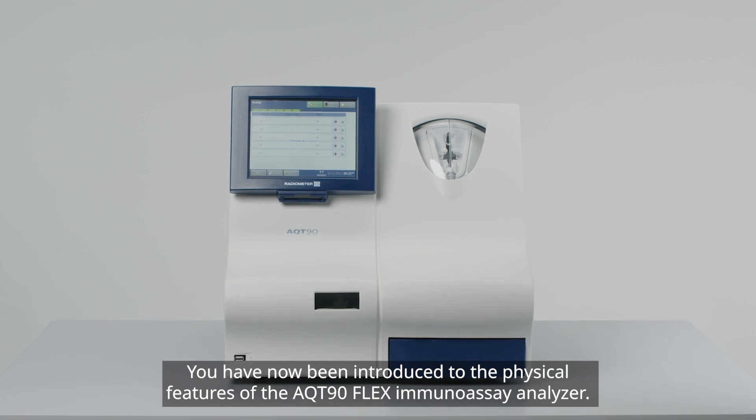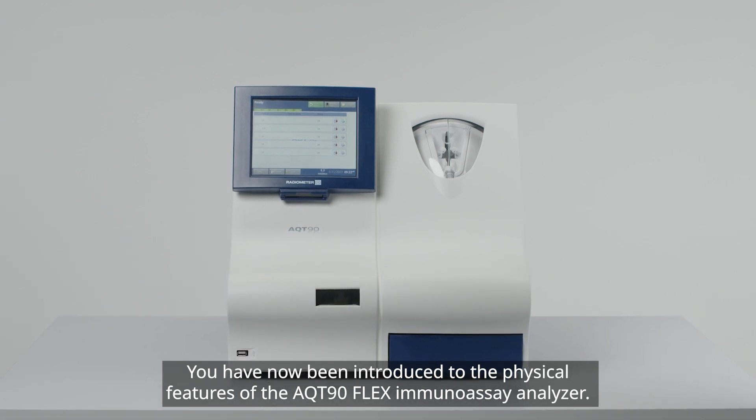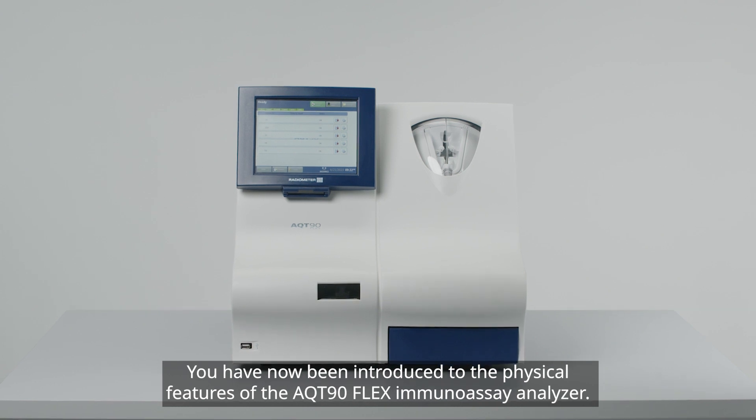You have now been introduced to the physical features of the AQT90 FLEX Immunoassay Analyzer.